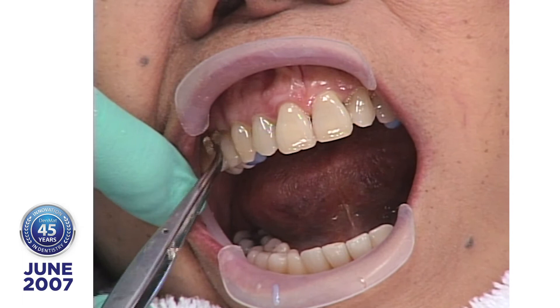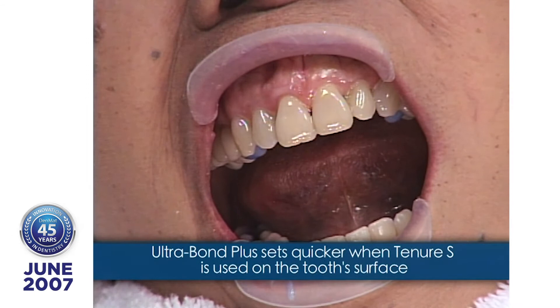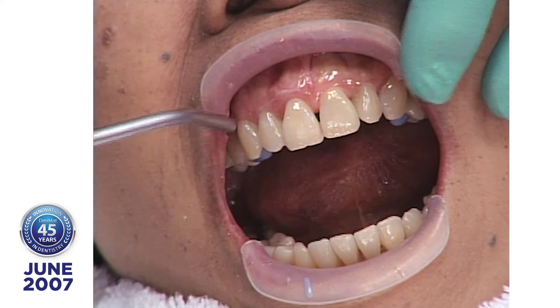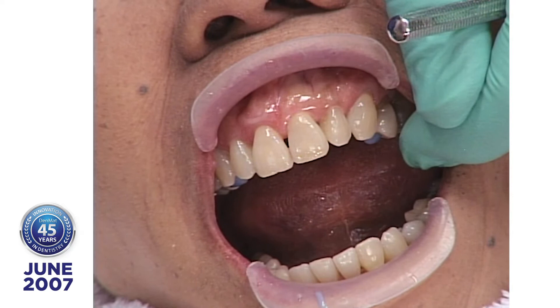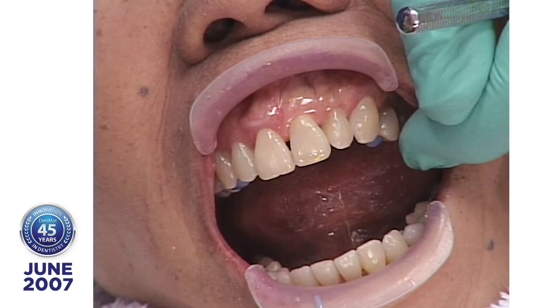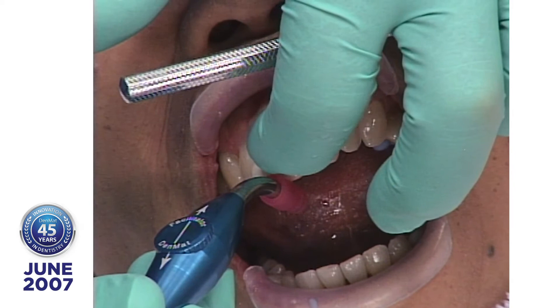One day I was doing a Try-In on my secretary — eight porcelain veneers — and I had inadvertently put the Tenure S on first, before I did the Try-In. We tried them in and I went to take them off and they didn't come off. No light cure — they just didn't come off. So Tenure S does two things: when you've selected the shade and got everything right with the central in place, then you apply your Tenure S and it gives you insurance.